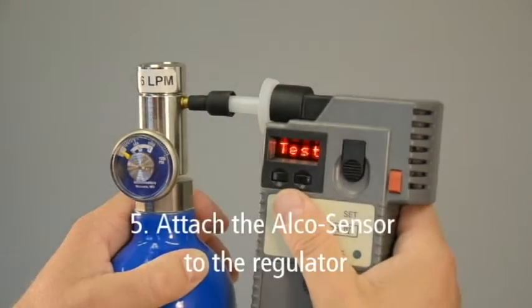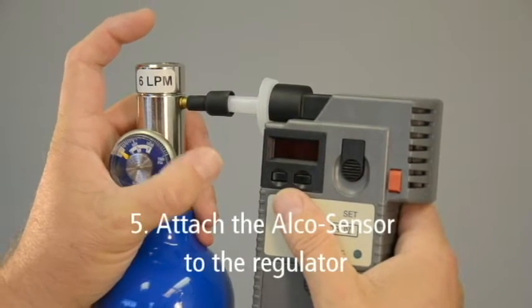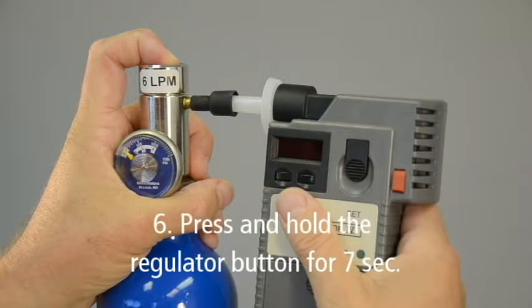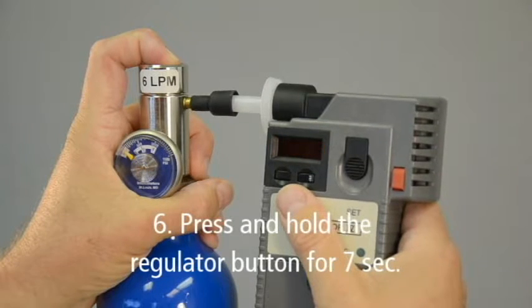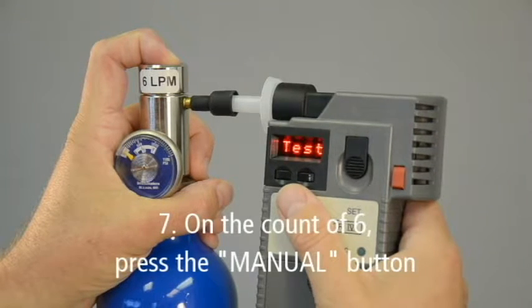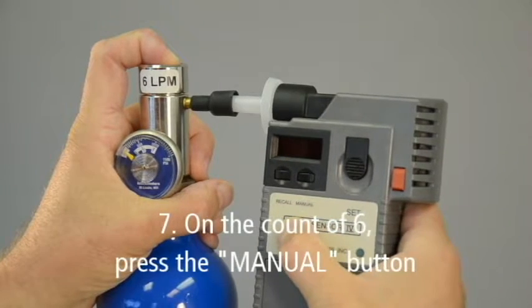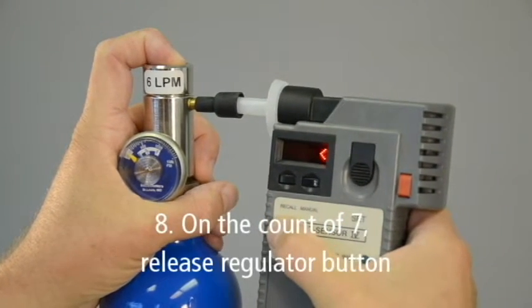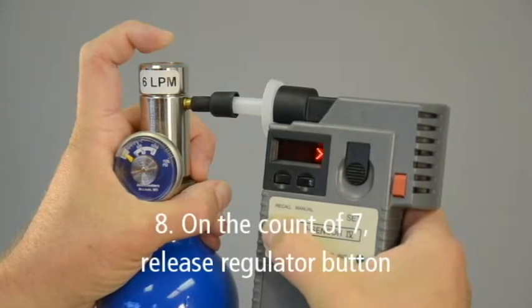Now attach the Alkosensor 4 to the regulator. To take a gas sample, press and hold the regulator button and count to 7. When you reach the count of 6, press the manual button on the front of the device. On the count of 7, release the regulator button.